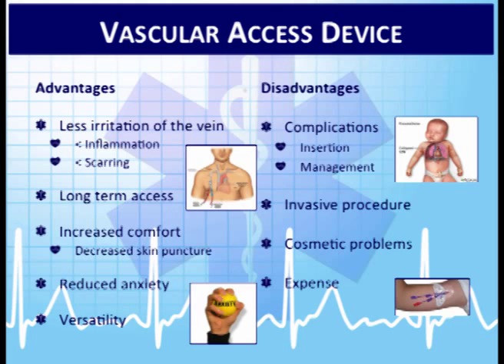The disadvantage is any procedure that we do in the hospital or in the field as paramedics, there can be complications. Insertion, we'll talk about some of the complications. The management, if they don't have skilled providers accessing their devices, we can break their line. We can cause a thrombus to break off. So it's very important as critical care paramedics in the field, if you're able to access these. We know that there's a lot of high-risk skills, but we don't use them very often. It's important for us to stay up to par on what's best practice for those procedures.